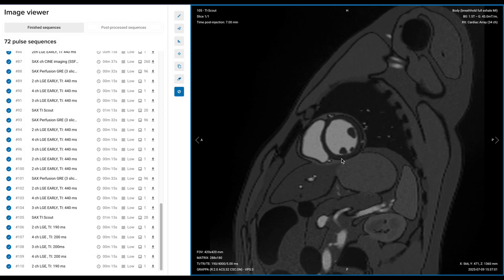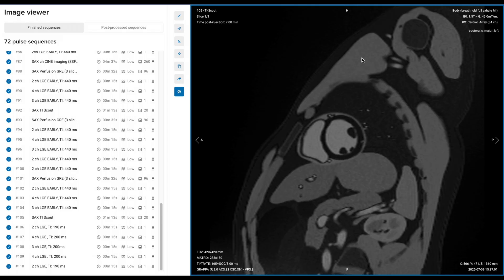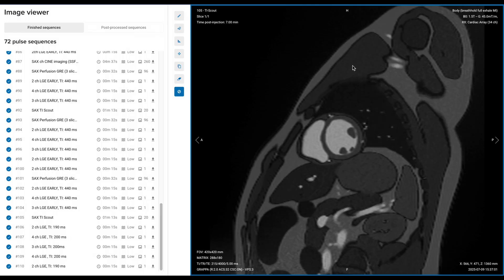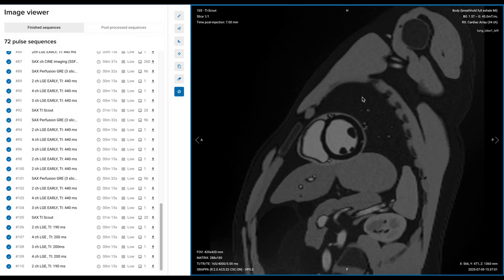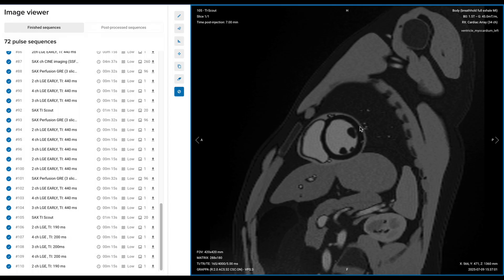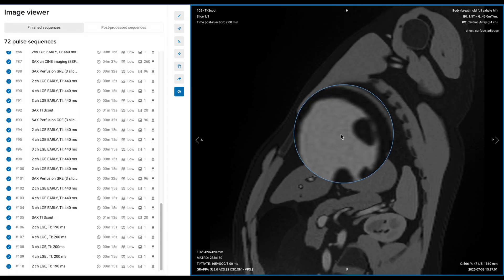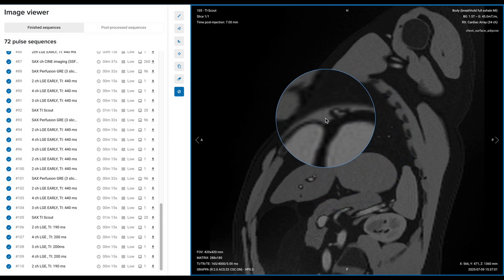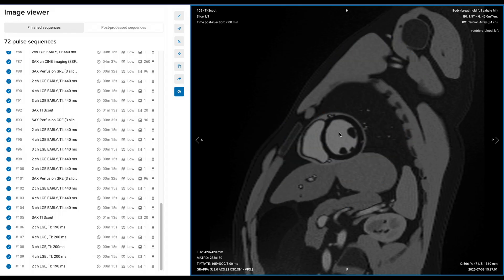The best image in our case is this one, or at the latest we could use this one. We can look at other muscles like this one, which should stay bright as we scroll through. But importantly, we want to see the myocardium that is black — the epicardium should be slightly brighter. So this is the epicardium, the bright trim around the dark donut. And here we have the blood pool, which will always have a very bright signal intensity.